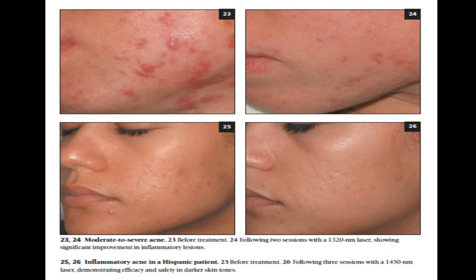Finally, eye protection needs to be provided in the form of goggles for the practitioner and goggles or gauze for the patient. Since mid-infrared lasers are able to penetrate deeply into the skin and are non-specifically absorbed by water, epidermal damage is an important consideration with these devices. Thus, the use of these lasers without their associated cooling devices may result in epidermal necrosis. Early 1320 nm lasers equipped only with a pre-pulse cooling led to an increased risk of blistering, hyperpigmentation, and atrophic scarring.